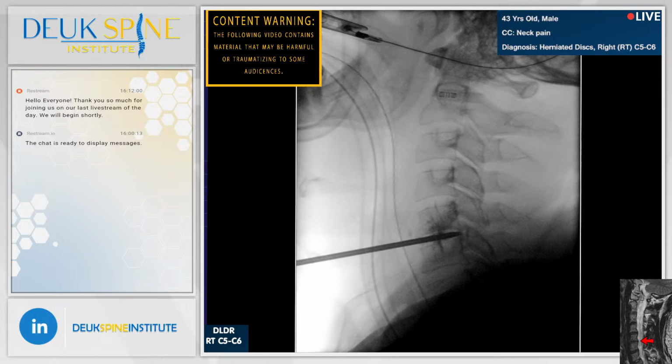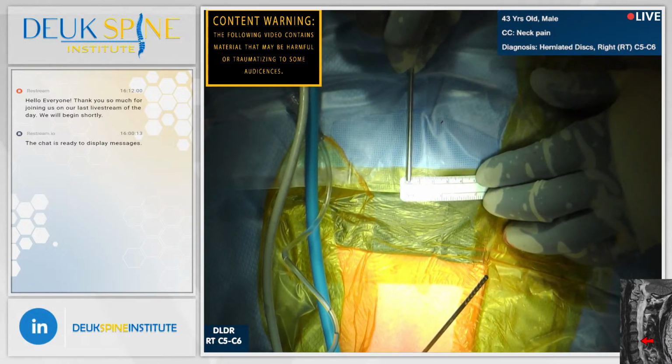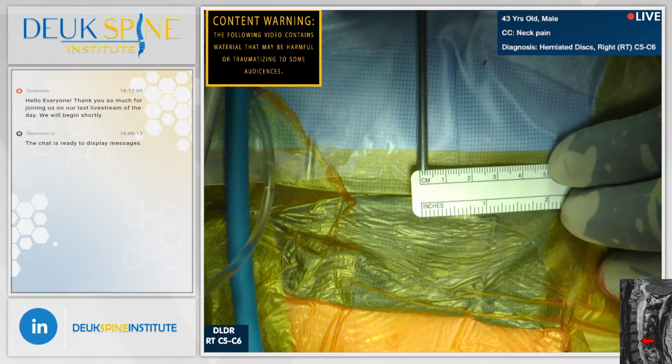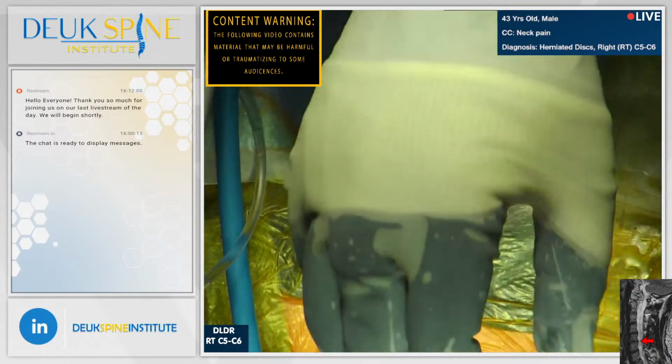All right, let me show you this. So you guys see the dilator sticking in? Now we're going to bring the tube down. We're going to do the entire surgery through this skinny little tube, and it's 4 millimeters wide. You all see this ruler here? Yes, we do. 4 millimeters. See that? Yes, we do see that. It's like a coffee straw.